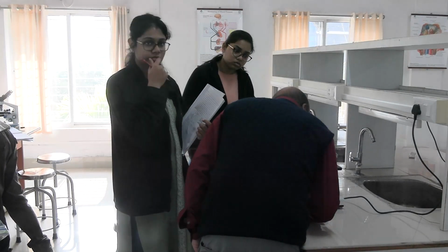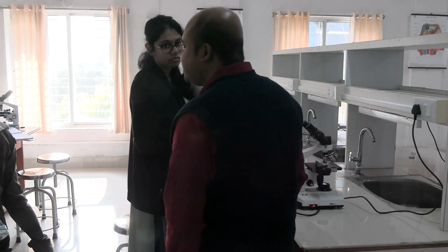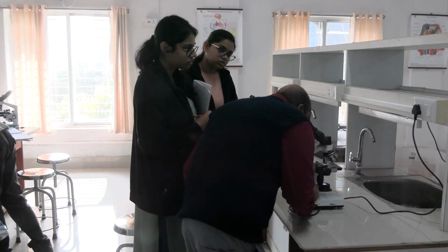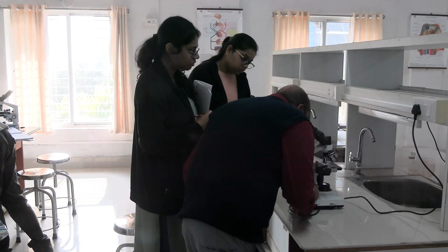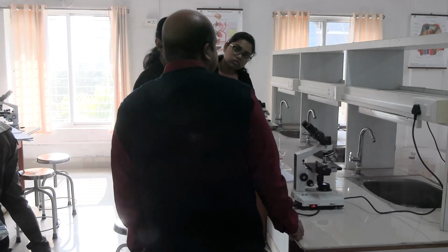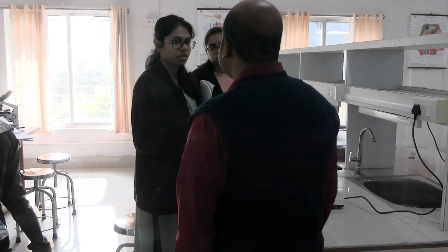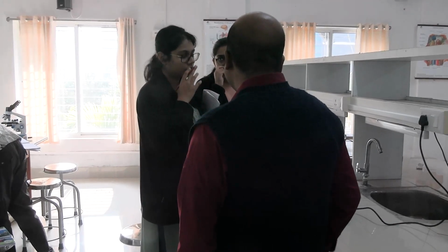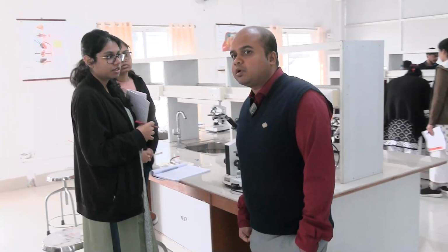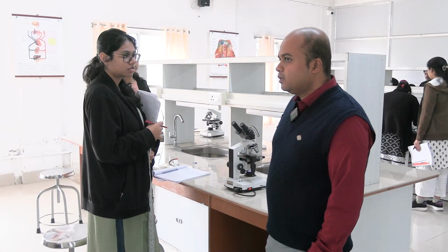These are the cells after fine focusing, but the dilution is incorrect. It is obviously incorrect dilution, otherwise it cannot be. The requirement is that blood is diluted 200 times properly. If blood has been diluted less, then this will occur. The density of cells is high, coagulated. Yes, the density of the cells is more, so how will you count so many cells? It is not possible to count the cells. That's why the dilution is required.